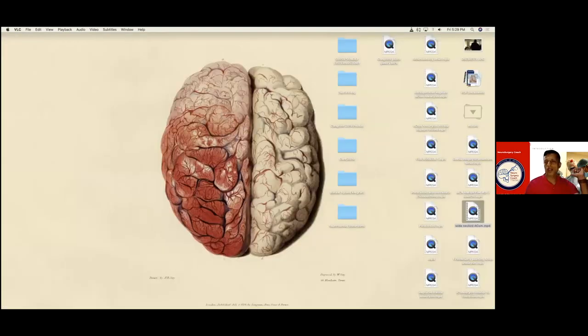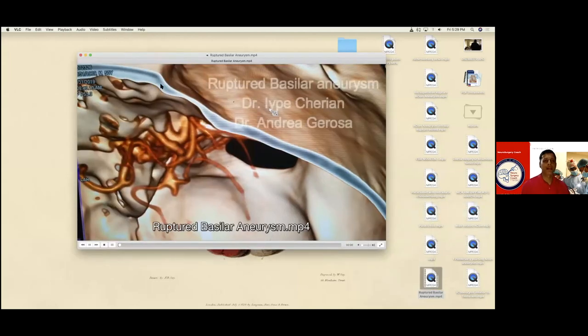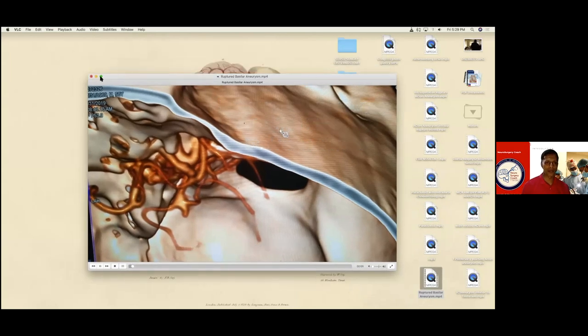Let's see another aneurysm. What do you guys want to see? I would like to see a basilar tip. You want to see a basilar tip? Unruptured one, preferably. Let's see a basilar tip. So this is a posteriorly pointing basilar tip. You can see this aneurysm — that is a P1, that's the aneurysm.